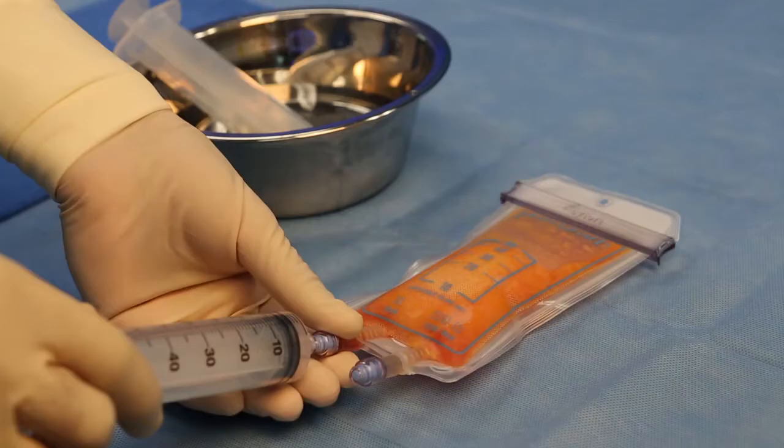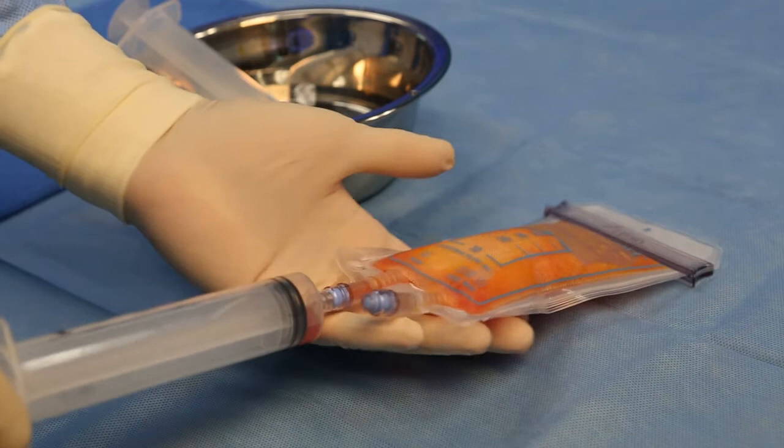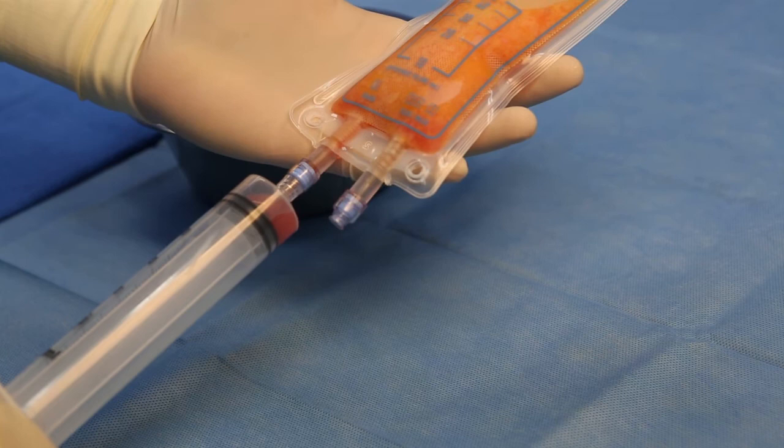After the waste is separated from the clean tissue, it is ready to be drained. For draining, first connect a 60 milliliter Luer-lock syringe to the drain port. Hold the PureGraft at an upright angled position and retract the plunger to pull waste fluid through the drain port at approximately 2 milliliters per second. This technique prevents air from being withdrawn in order to avoid collapsing the system.